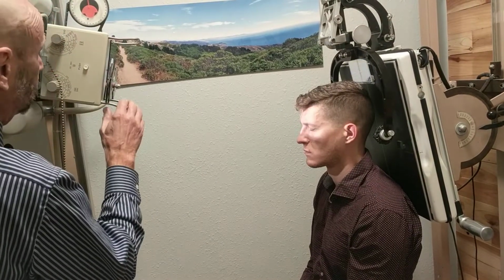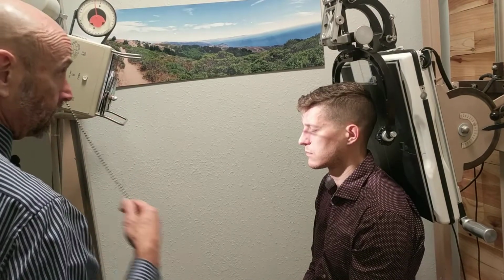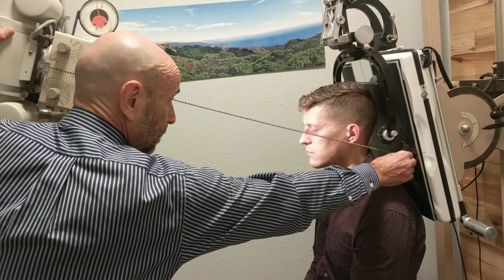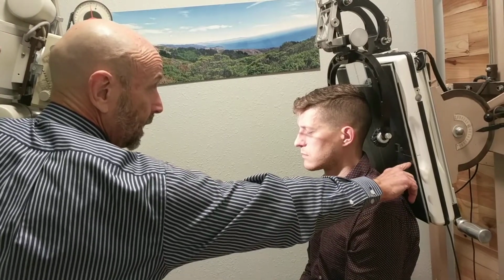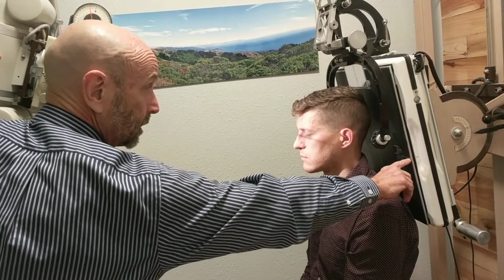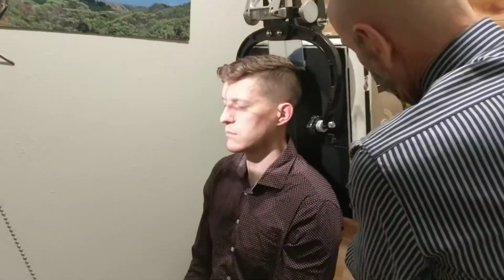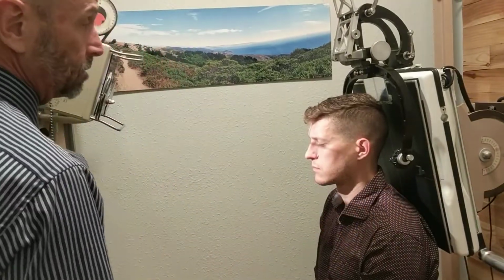So now, close the eyes please. We're going to turn on the collimator light and match the light to the string. So now what we've got is the two are completely in line, so that's going to give us an S3. However, it's going to project the atlas 1 inch below the ideal spot. So we're going to then rotate this down, or move the bucky down until the shadow of the horizontal crosshair is at the center of the bucky.